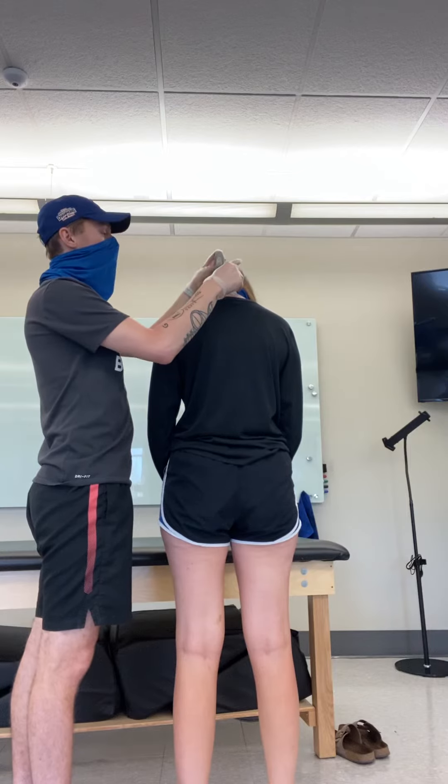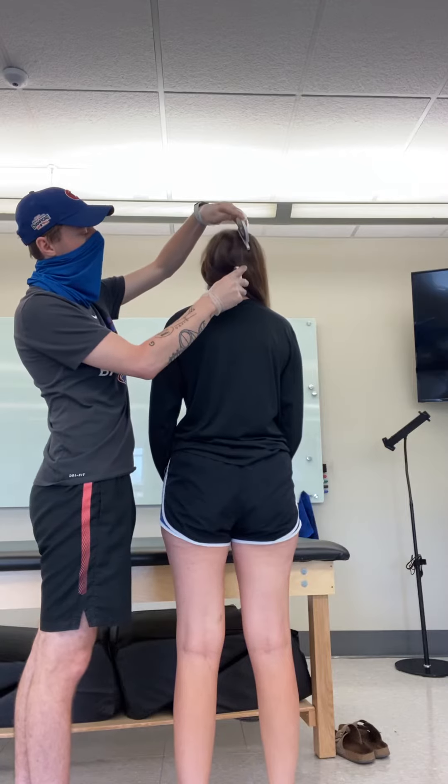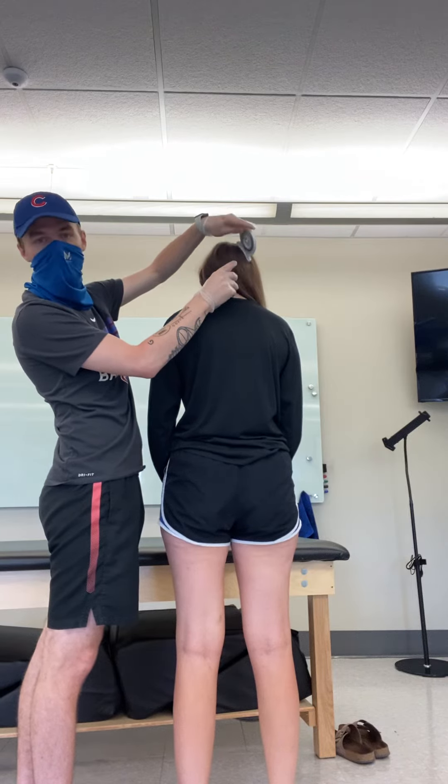When you do extension, you can go the opposite way and keep them in the same place. So go backwards for me. For the bottom one, she's at 10; the top one, she's at 55. So that's about 45 degrees.